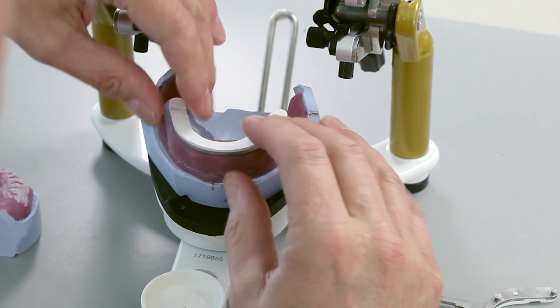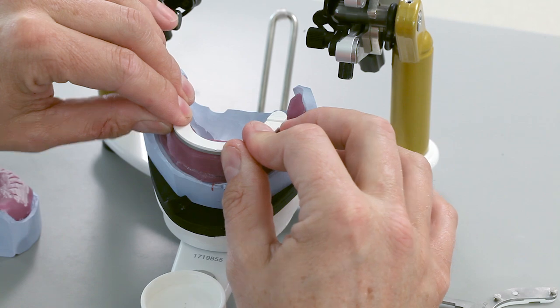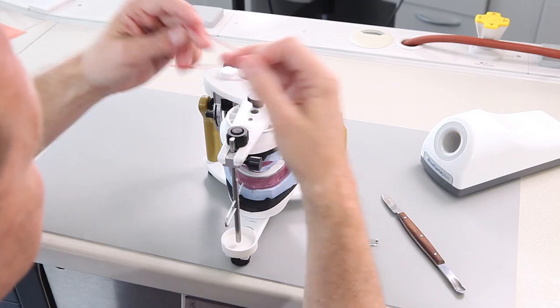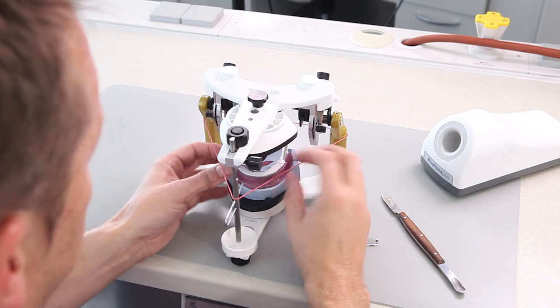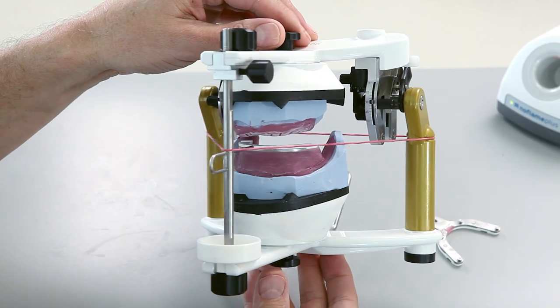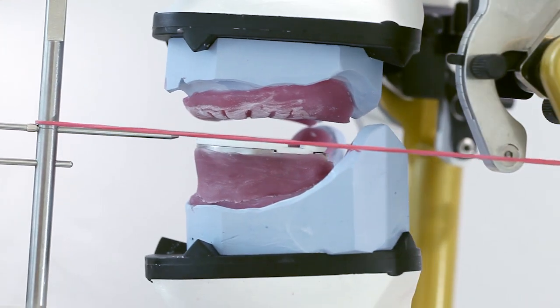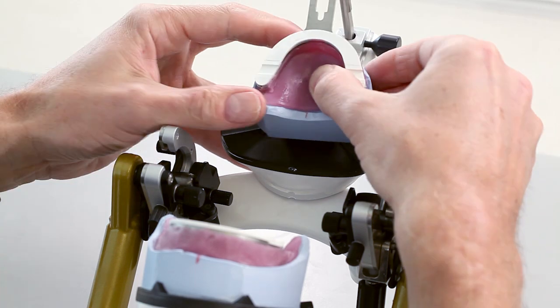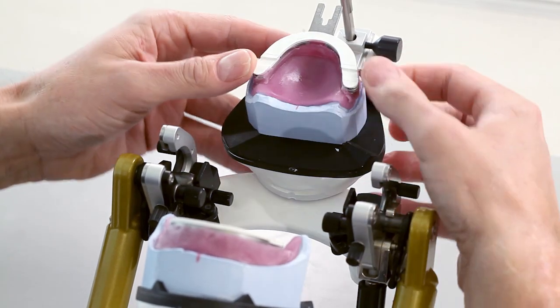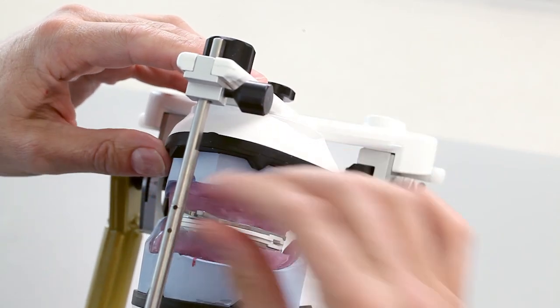Attach the gnathometer M bite support to the lower rim. Then align the prepared lower rim with the occlusal plane using uncured tray material. Take the anterior midline and the defined retromolar pads into consideration. Polymerize according to the manufacturer's instructions. For the maxilla, the gnathometer M is mounted in such a way that the white bite plates close parallel to the mandibular arch.